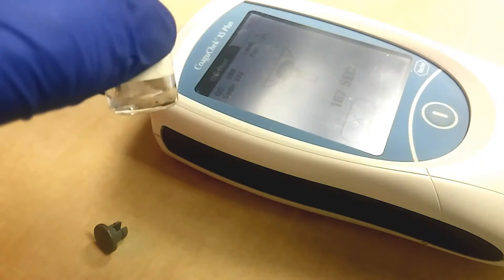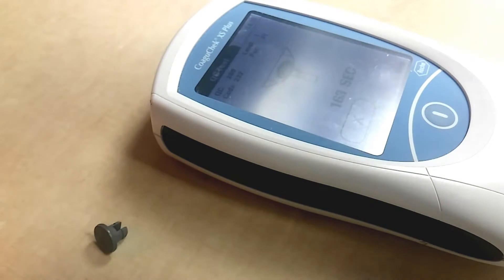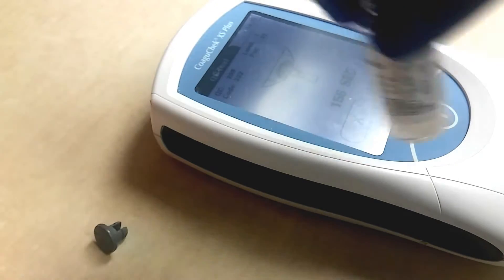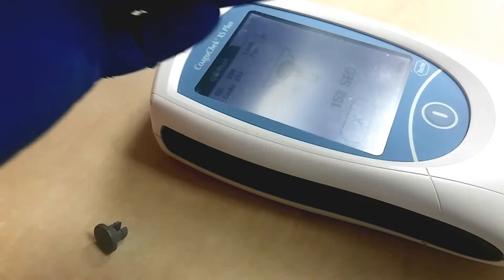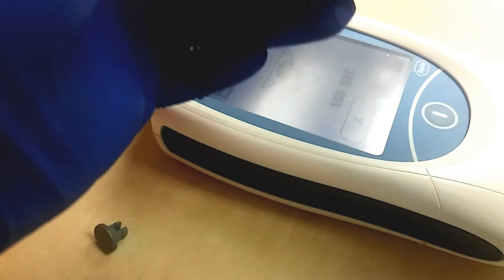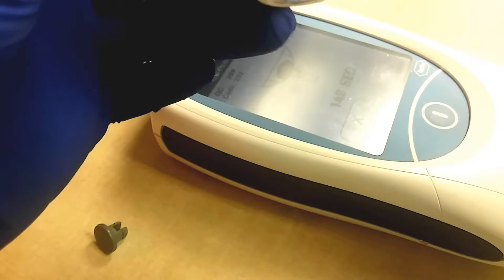Then you're going to unscrew this and add it in. Now you can see it counts down — right now it's at 186. You want to make sure this is good and mixed up. You can put the lid back on. You don't want to get any bubbles in here.